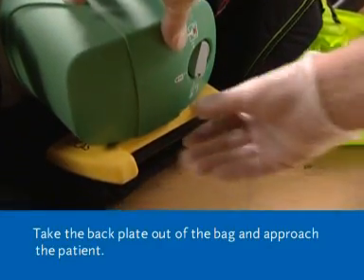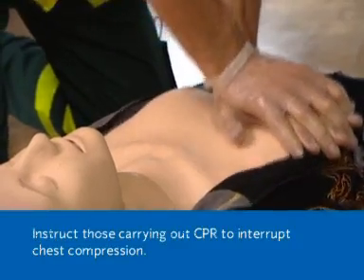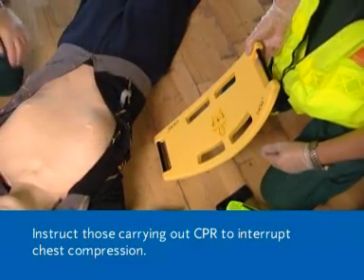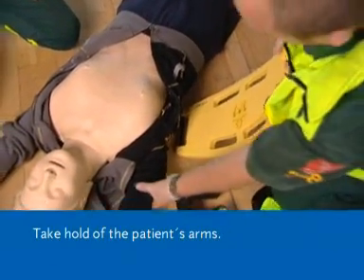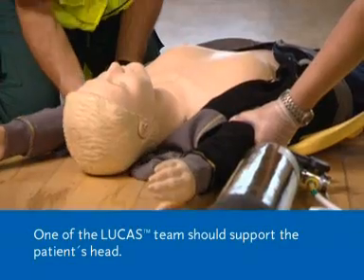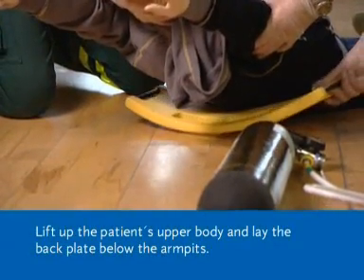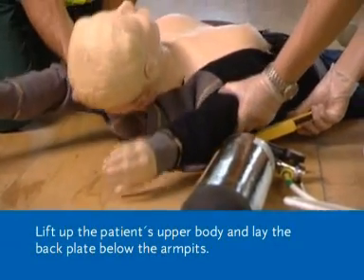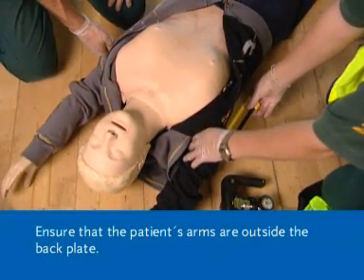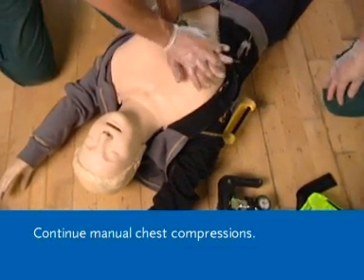Take the back plate out of the bag and approach the patient. Instruct those carrying out CPR to interrupt chest compression. Take hold of the patient's arms. One of the Lucas team should support the patient's head. Lift up the patient's upper body and lay the back plate below the armpits. Ensure that the patient's arms are outside the back plate. Continue manual chest compressions.